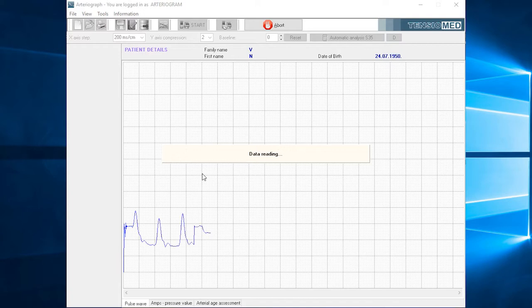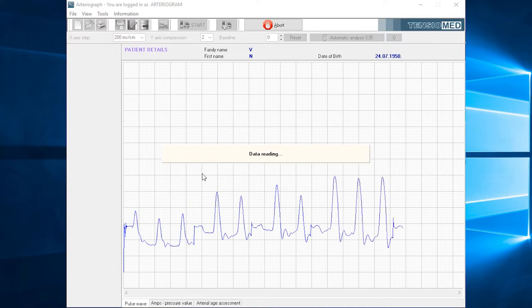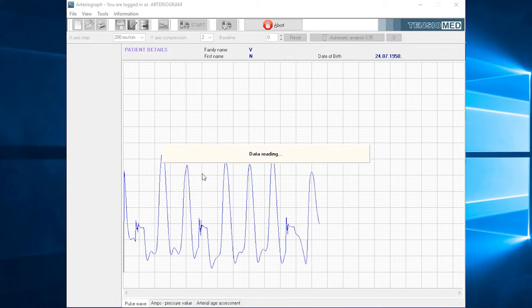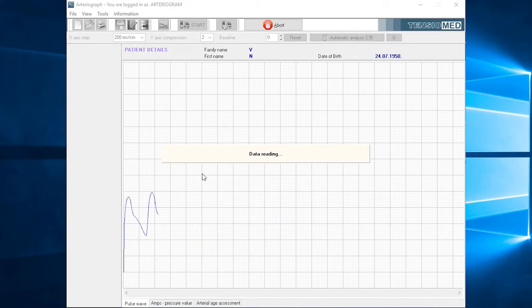Here you can see the signals and the pressure curves obtained from the upper arm cuff and transmitted in real time via Bluetooth to the computer software. The device first measures the blood pressure of the patient, and then, according to the actually measured blood pressure, the device pumps back to the diastolic pressure, so pressurizing the cuff to the diastolic pressure, collecting and obtaining so-called volumetric signals.